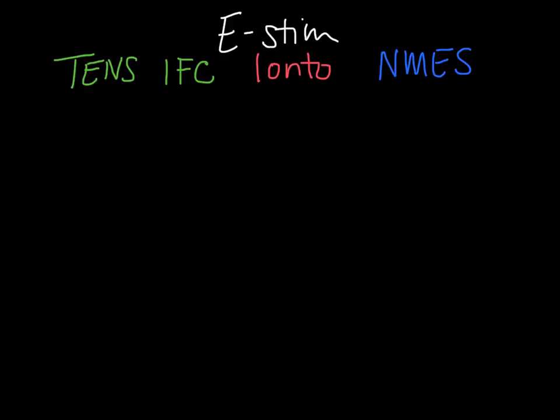This is a very brief tutorial on how electrical stimulation may be used in physical therapy. So right here I have listed sort of the primary uses of E-stim in PT. We start over at the left with TENS, and then IFC, Ionto, and NMES. So those are your four primary modes of electrical stimulation.